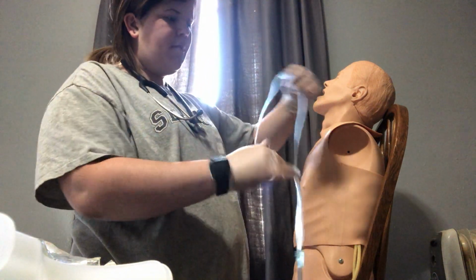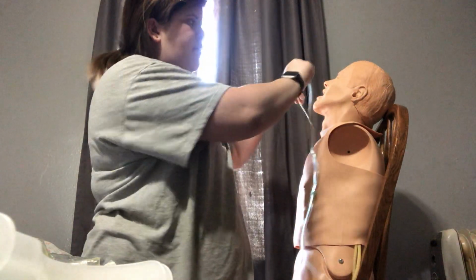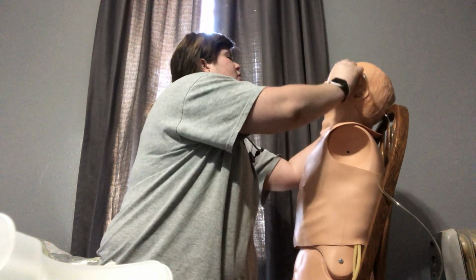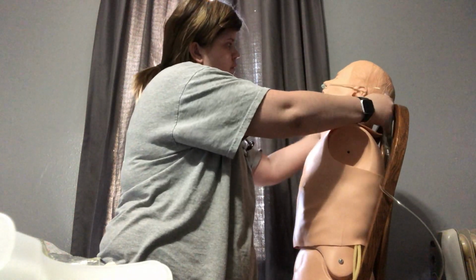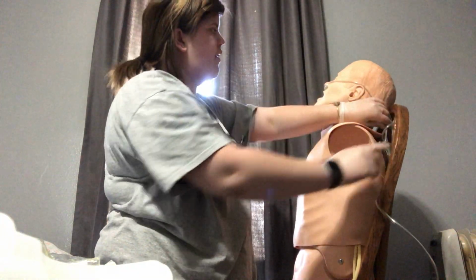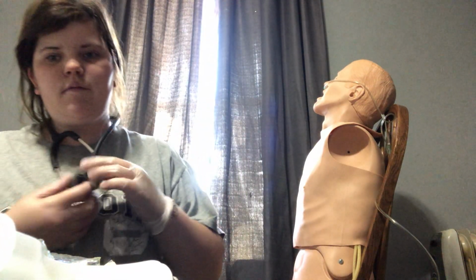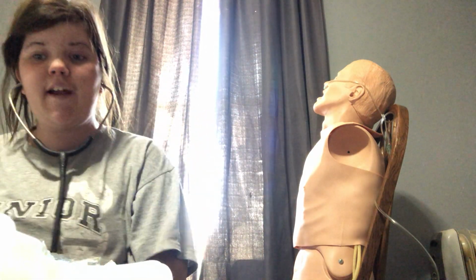I'm going to apply this. Normally it would be in front, but tighten it. And we're going to reassess the patient's respiratory depth, rate, and effort and get some more lung sounds and another O2 sat.